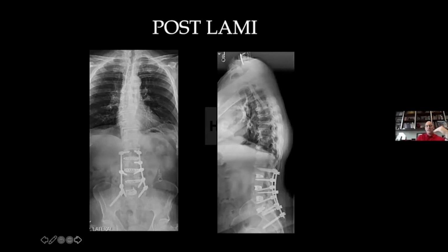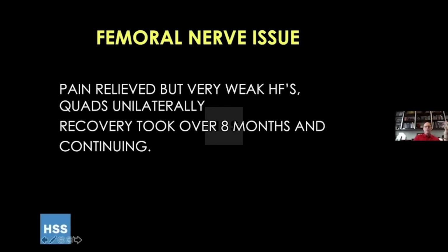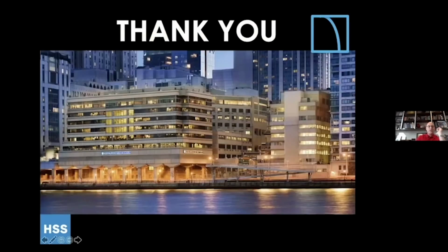Top to bottom, we did an anterior L5-S1 in the lateral position and all this instrumentation. But he ended up with a very weak kind of a femoral nerve problem that was really prolonged, and his recovery took about 8 months. He's now finally doing better, but he had to live in the basement because he couldn't even get up stairs. And I just show this case to say he'll probably ultimately do well, but you have to be wary that they may not always do well. But I will say, thank you, Chevy, for turning me on to this, and for those who've developed it, because I think it is a good innovation in spine surgery. So thank you.